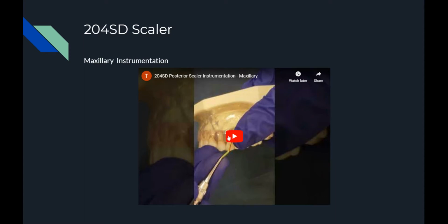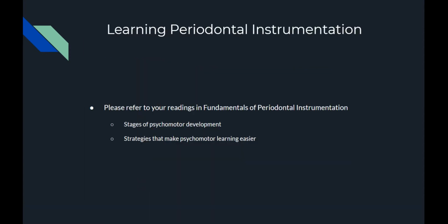On the maxillary arch. Learning periodontal instrumentation. Please refer to your readings in Fundamentals of Periodontal Instrumentation, Stages of Motor Psychomotor Development, and Strategies that will make psychomotor learning easier.